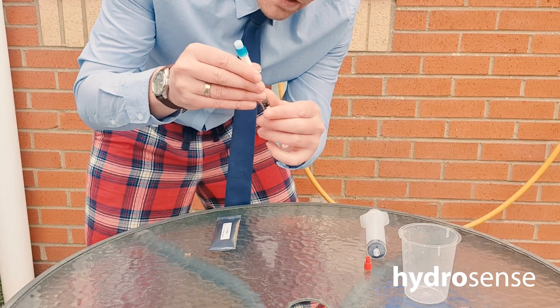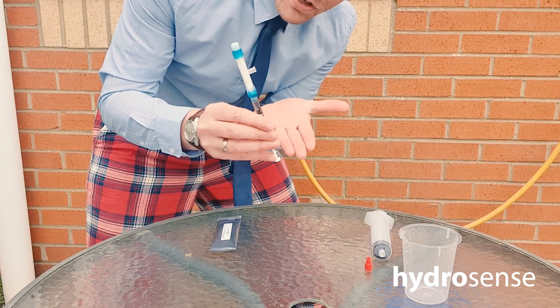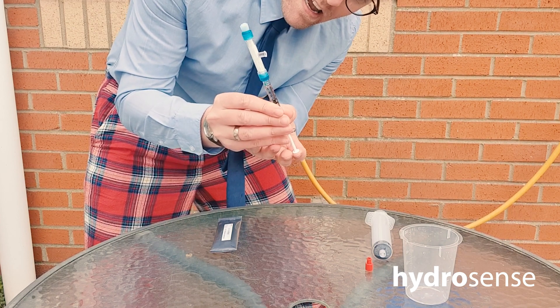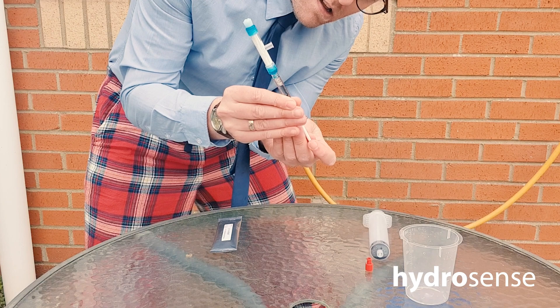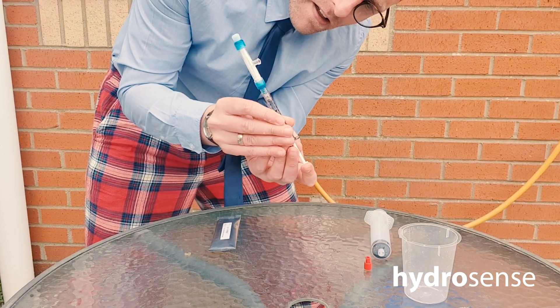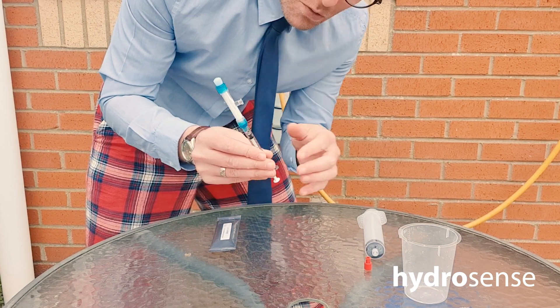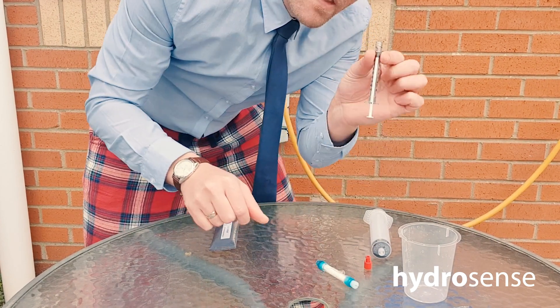We attach the buffer solution to the other side of the filter, and we want to push this buffer solution into the filter and backwash it three times. We draw it back a little bit to 0.5, push it all the way through — that's one, two, three. Then we draw back to 0.5 and push it all the way to 0.1, making sure to remove any air bubbles. It's very important we take that to 0.1, because that 0.1ml is the amount of solution we need to apply to the HydroSense strip.